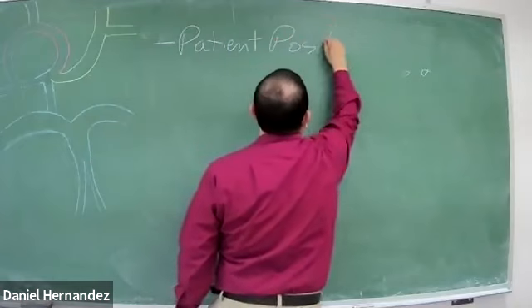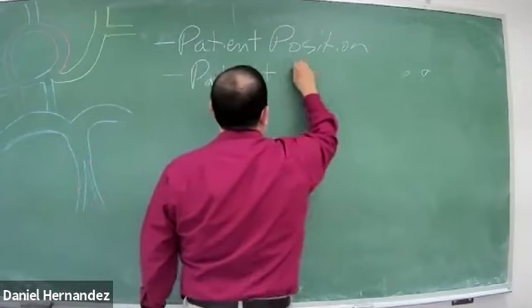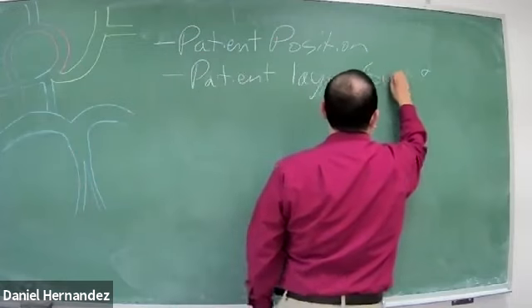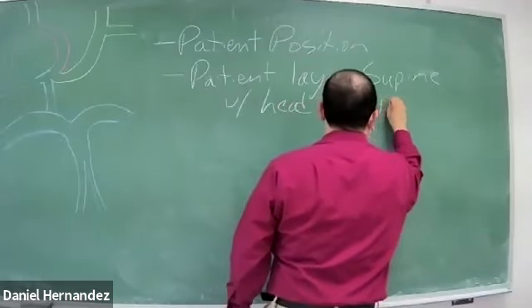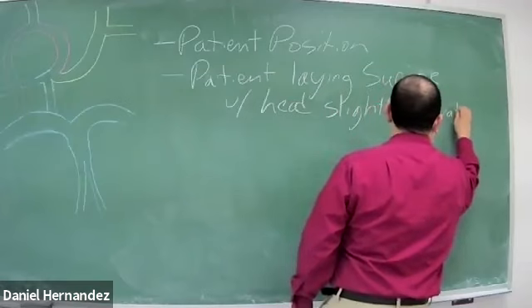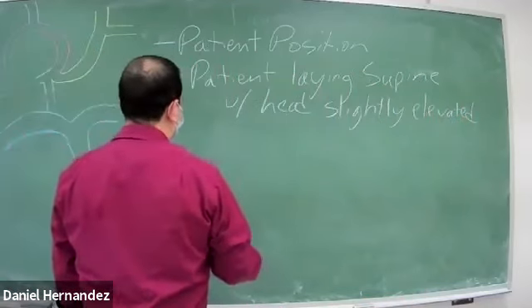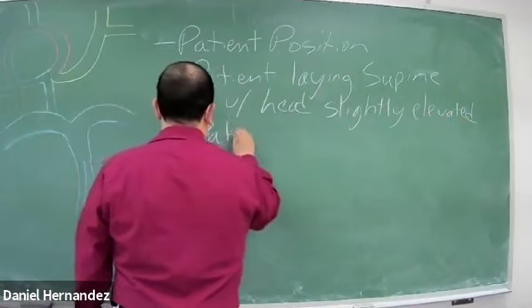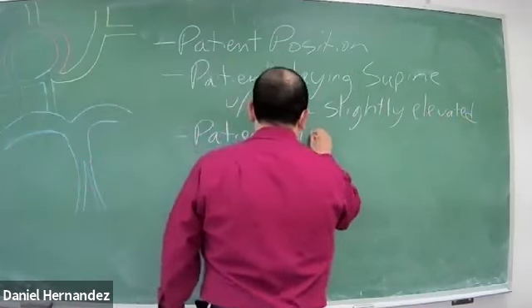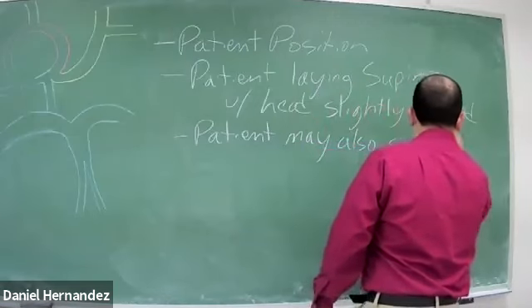Position. We have the patient laying supine, head slightly elevated. The patient may also sit, preferred.